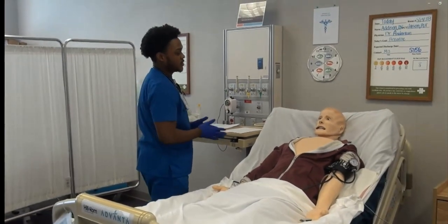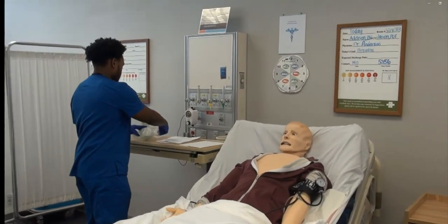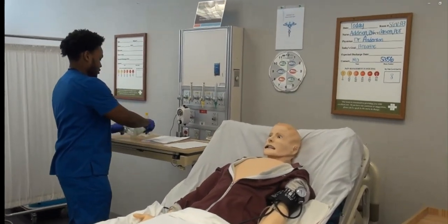So today I'm going to be placing you on some oxygen by nasal cannula. And then we would get consent from the patient.